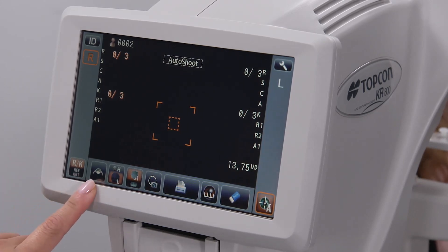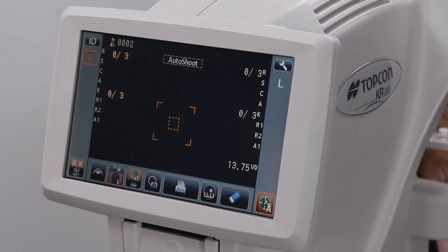The cataract mode icon can be used to increase the likelihood of acquiring refraction data through a cataract or other media opacities.